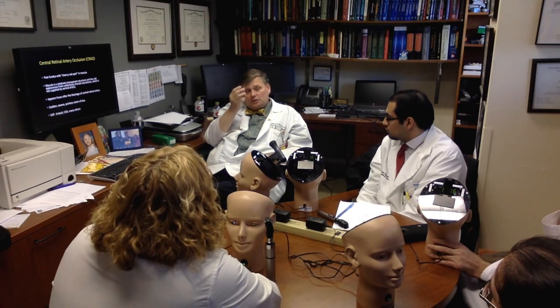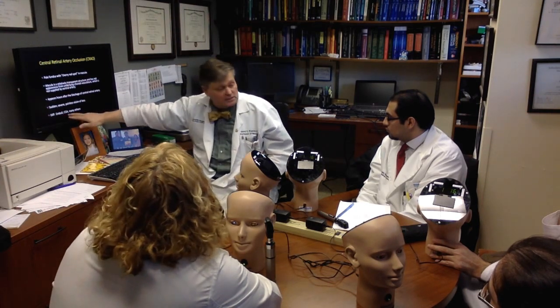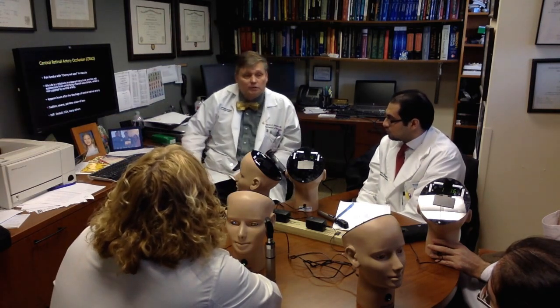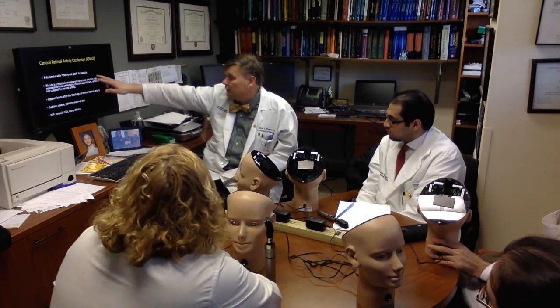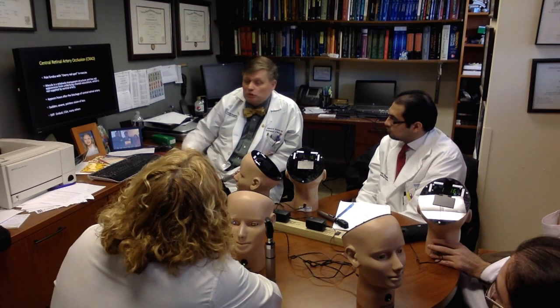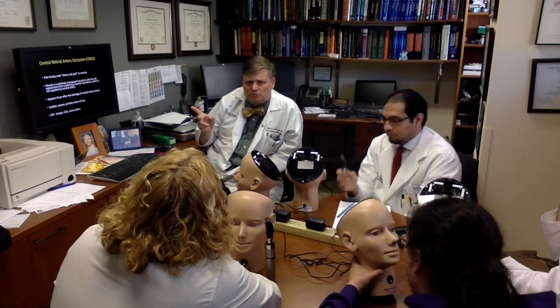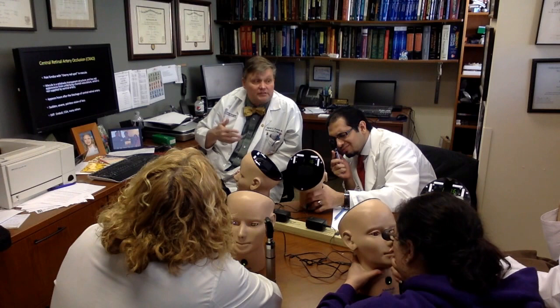However, it can also be a local vasculopathy, and the one we worry about the most is giant cell arteritis. So in the right age group or the right clinical setting, somebody could have a central retinal artery occlusion from temporal arteritis. Now, this cherry red spot may take a few hours to develop. When you first look at it, you may just see a totally pale retina. It's like, I don't really have a good red reflex here. It's really pale. But after a few hours, this develops. So if someone came in right away, it may not be obvious. But if you ever see it, this is a classic pattern.